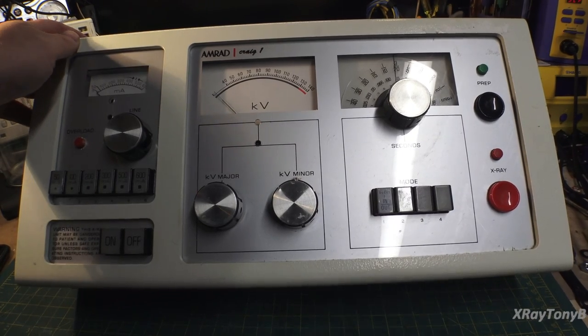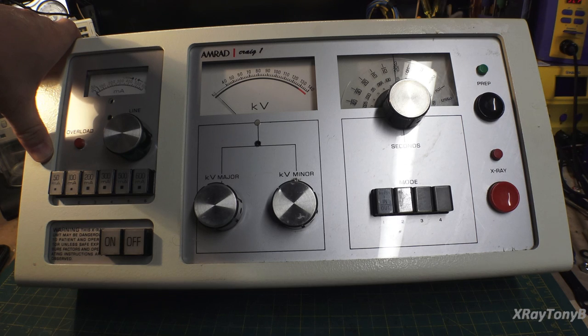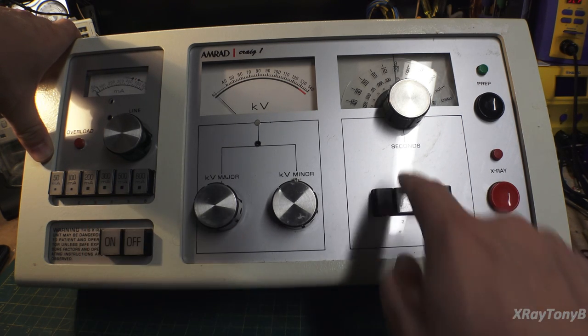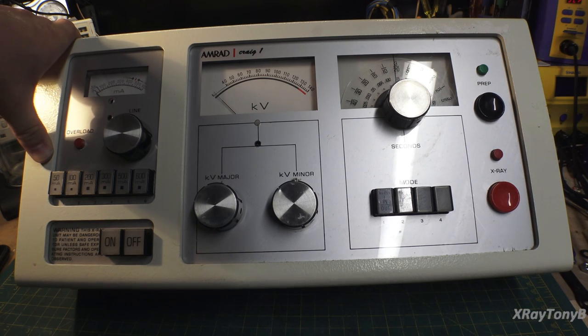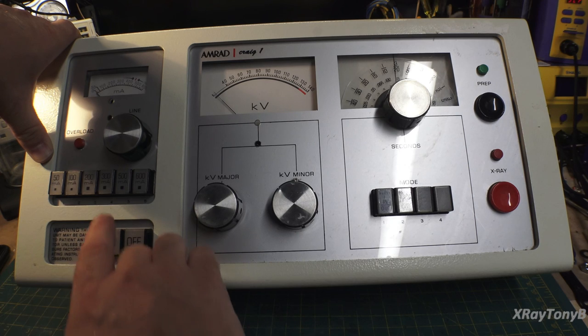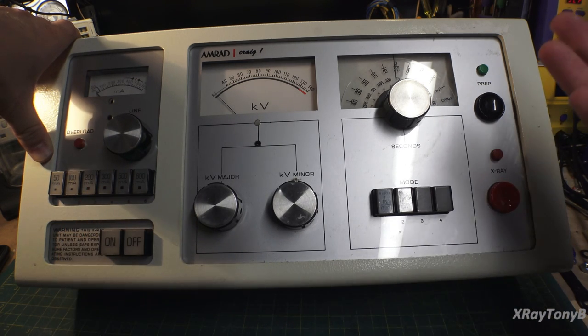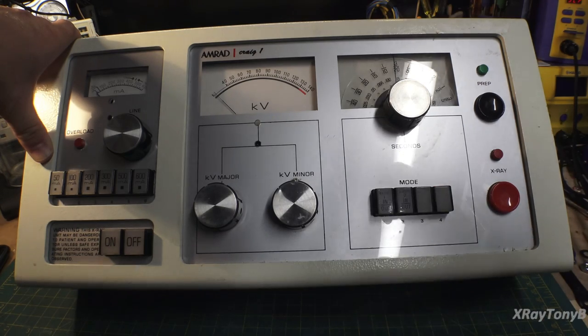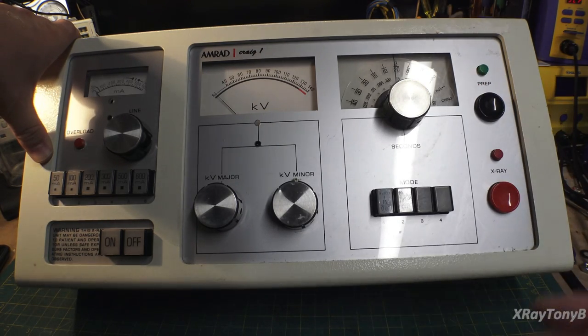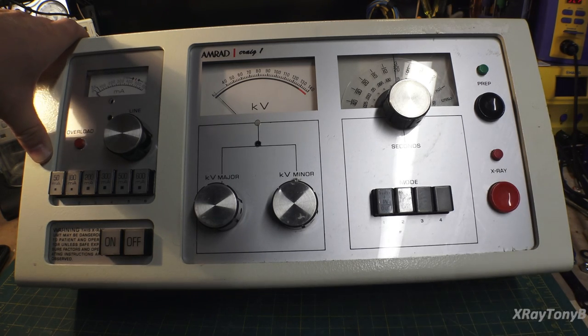If you multiply the two together, you get a factor that we refer to as mAs, which is just an acronym that means milliampere seconds. And they're interchangeable. So the higher the mA, the faster the radiation will expose the receptor, which would be your film or your digital detector or whatever.